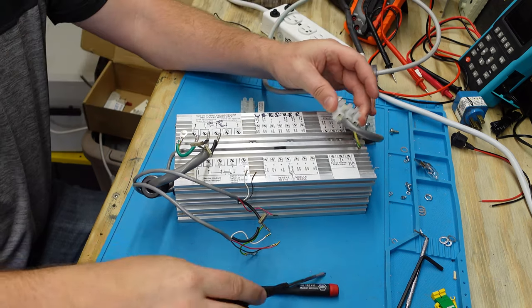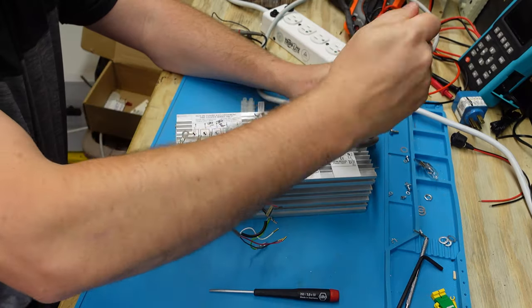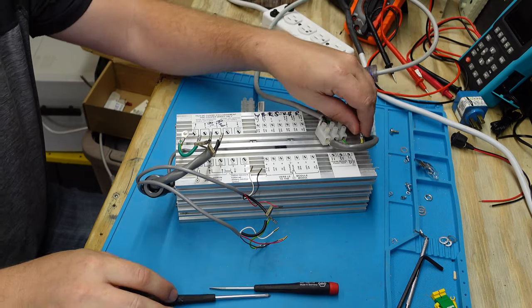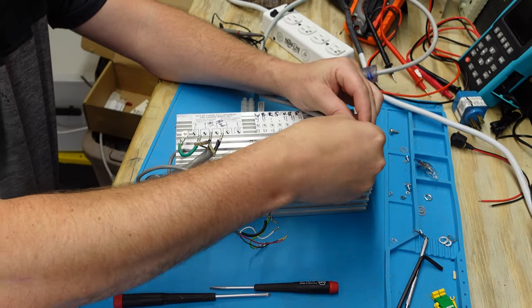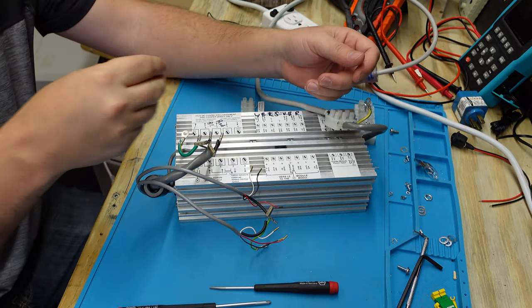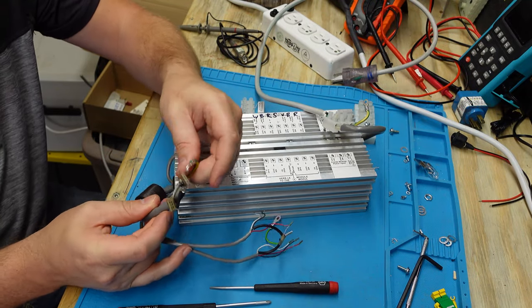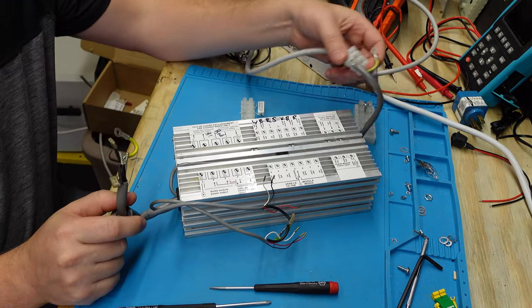So the reason I have to take all these blocks off is because the end caps are just stamped steel and these wires all go through the end caps. So instead of doing like a C slot and just having them off to the side, which would be way easier, they actually have a hole, so I have to pull the wires directly through. Which means, shoot, that means I have to, got a choke here that I've got to get off. That's going to be real fun.